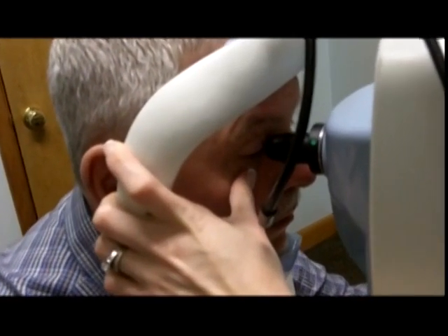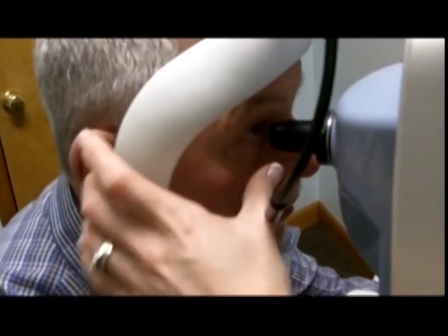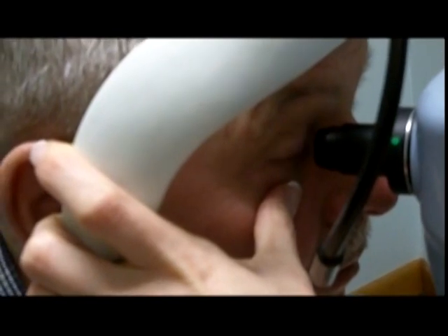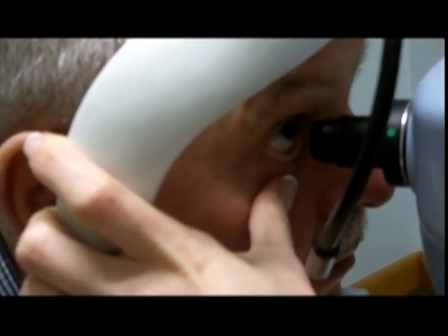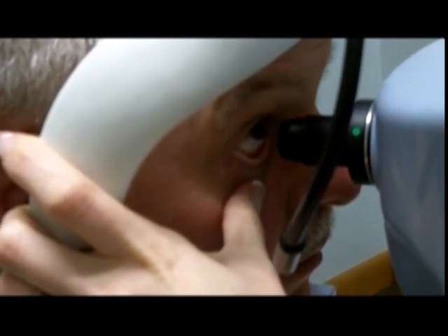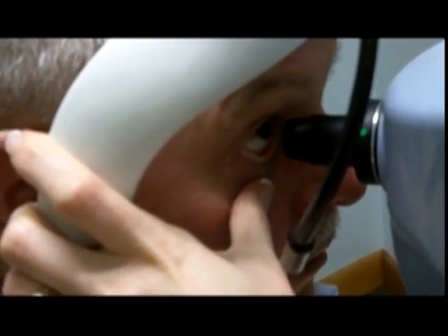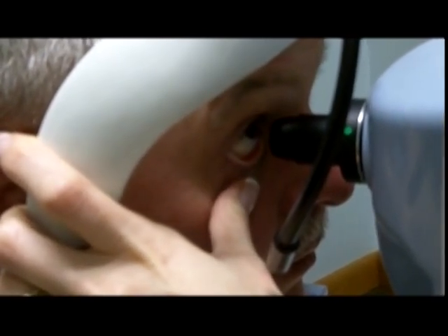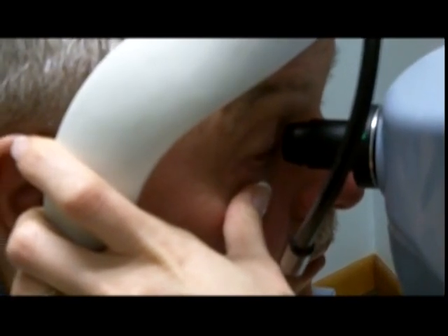The same thing applies when we're evaluating the bottom of the lens — I would have him look up for me. I'm going to grab with my hand here and hold on and grab the bottom, maneuvering the OCT with my right hand because I'm right-handed. So I'm going to grab his lid, have him look up as far as he can, grab the bottom lid, and use my right hand on the joystick to make fine adjustments and get the scan as I'd like it to appear on the screen.